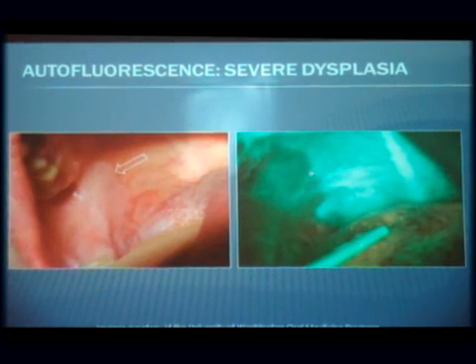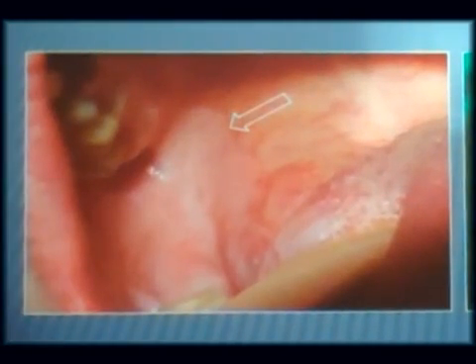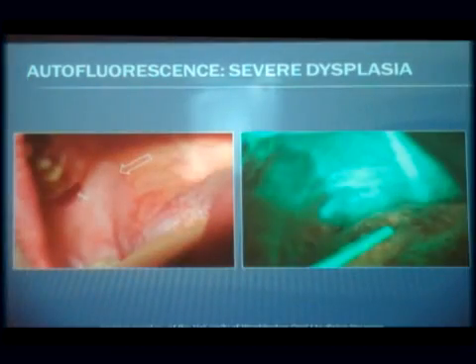And another final example, just this sort of a whitish, grayish, fairly well-defined lesion that almost looks like a very thin skin graft. It's just a strange little thing, but you can see that the entire lesion was dark, and there again, I think there were about 5 biopsies done, and some of those had severe dysplasia. They all had some kind of dysplasia.